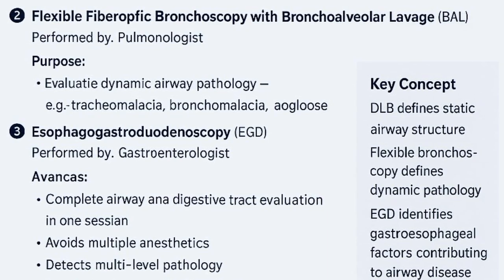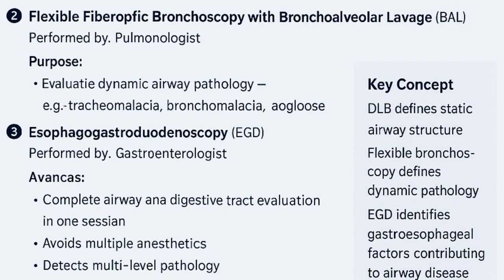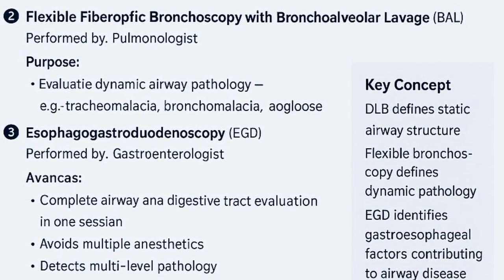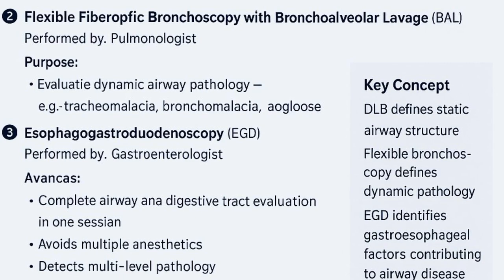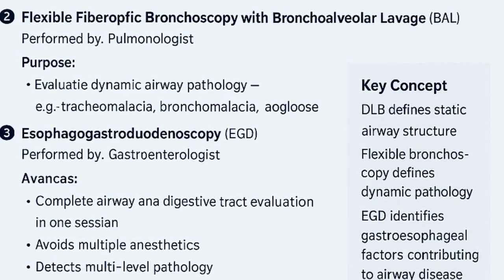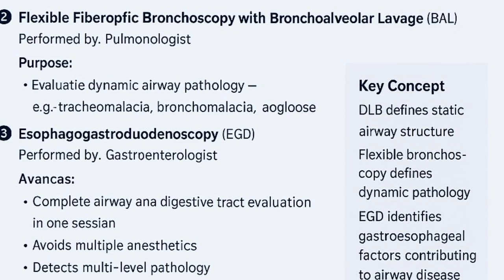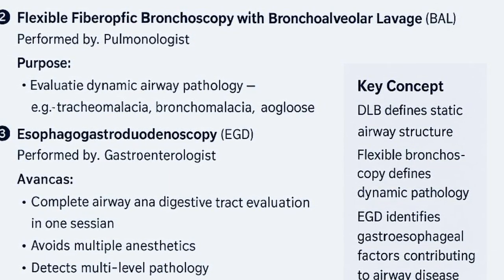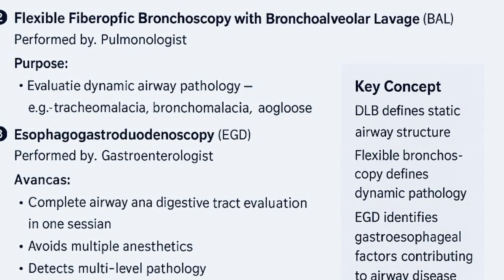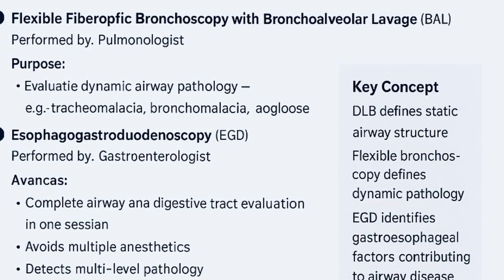esophagogastroduodenoscopy. This EGD is done by the gastroenterologist. Purpose of this is to evaluate esophageal, gastric or duodenal causes of GERD. It is for ruling out gastroesophageal reflux, esophagitis, and structural abnormality in the stomach or duodenum. It can also help to take biopsy in esophagitis or GERD cases.